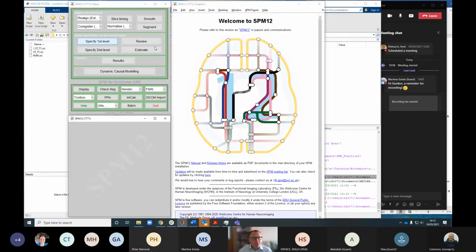In functional imaging, you're usually looking at a task compared to a resting state. So first you have to do some statistics at the individual level to test differences between task and rest. So that would be our first level statistics.